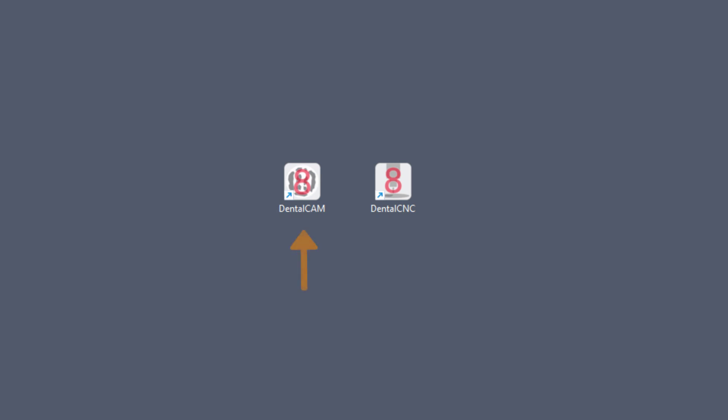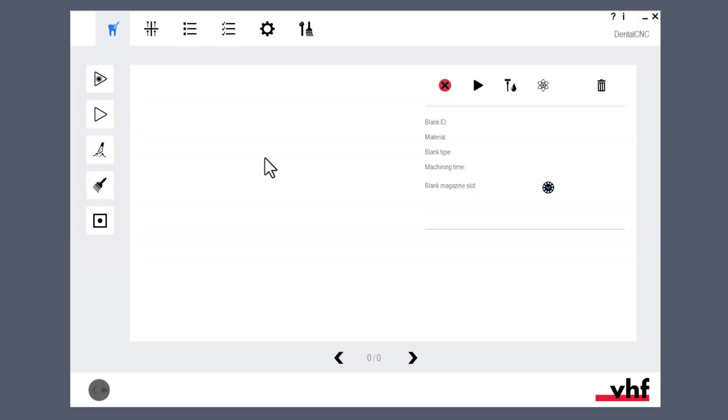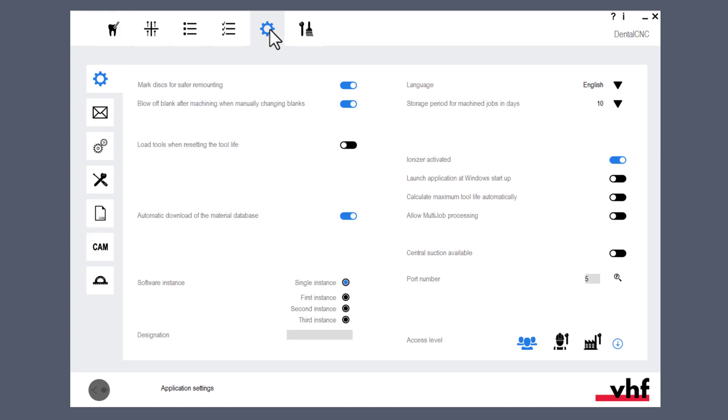In Dental CNC, open the application settings view to determine the USB port number and connect to the machine. Select the icon next to the port number input field. The application will now display the new port number next to the icon.